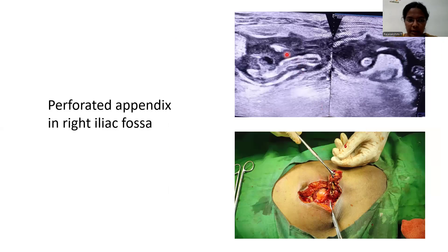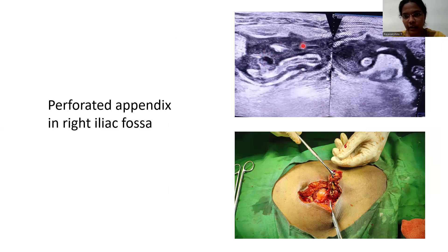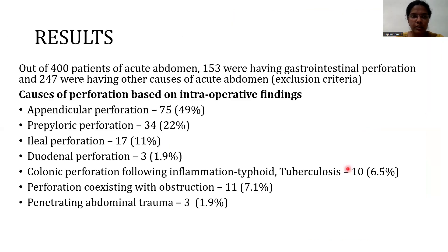Perforated appendix in the right iliac fossa. This patient presented with acute abdominal pain and was suspected to have perforation clinically because of guarding at the right iliac fossa. We can see an inflamed appendix with a suspicious breach at the base, inflamed adjacent bowel loops, and free fluid. It came out to be a perforated appendix.